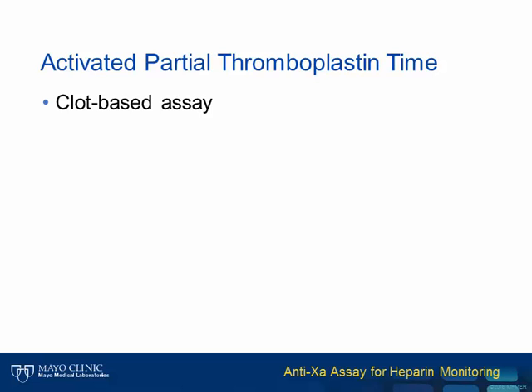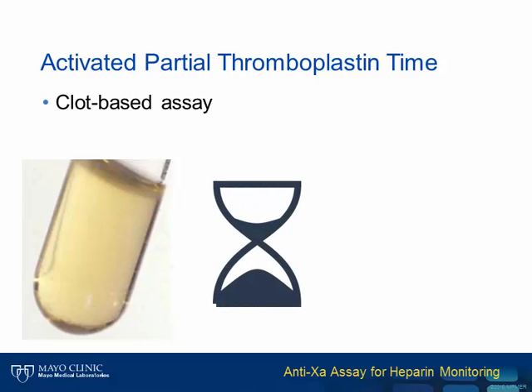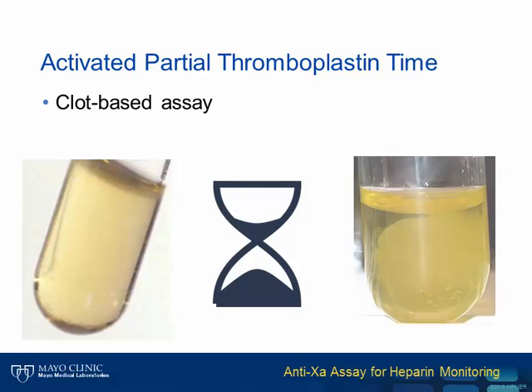It is a clot-based test that requires citrated patient blood to produce platelet-poor plasma, or PPP, for testing. Phospholipid and an activator are added to the patient's PPP, and this mixture is allowed to incubate. Calcium is added to reverse the citrate, and the clotting time is measured.